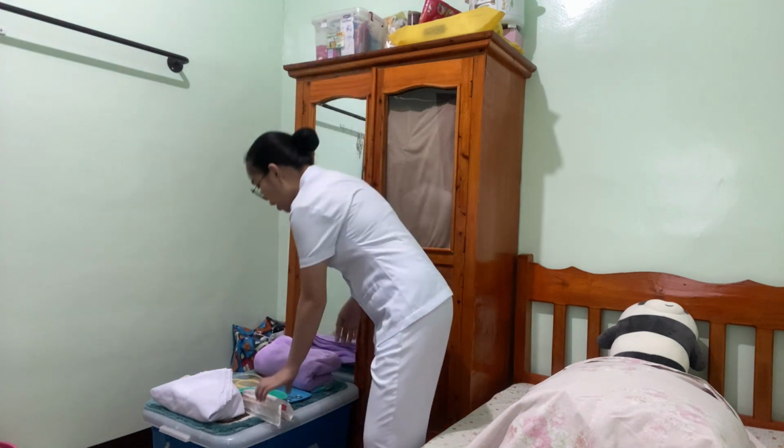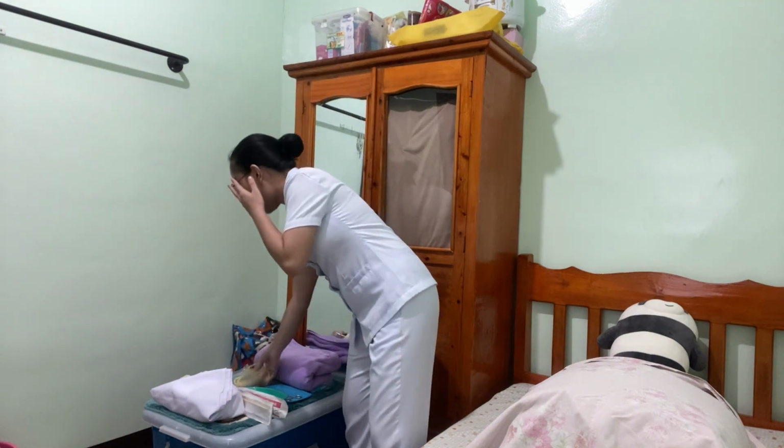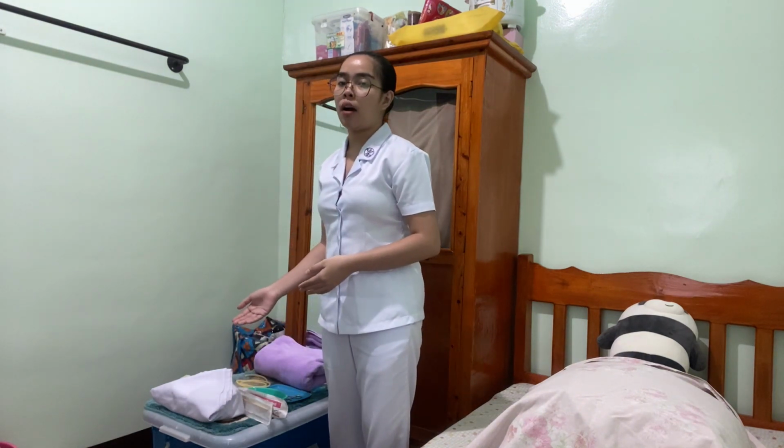So after doing that, I have prepared the necessary equipment which saves us time and energy, and this includes the two-way Foley catheter, the urinary bag, and our catheterization set.